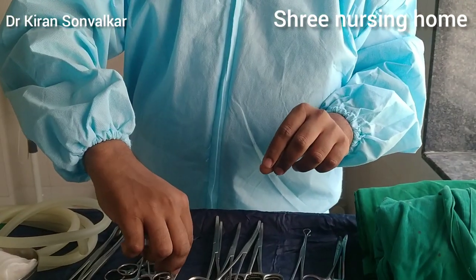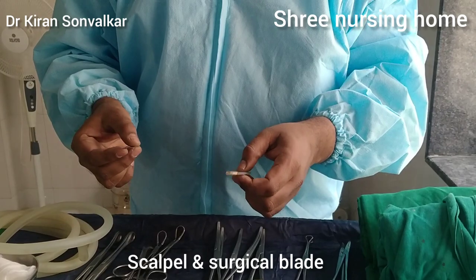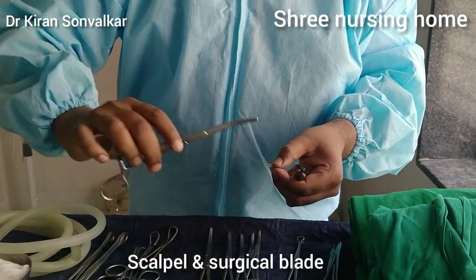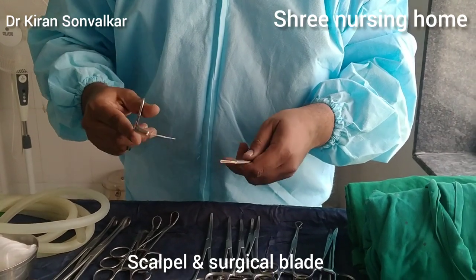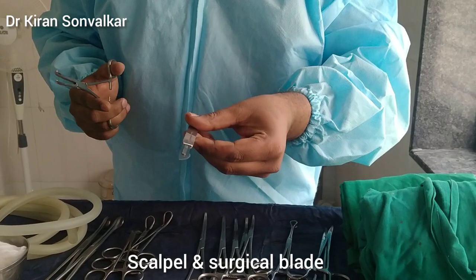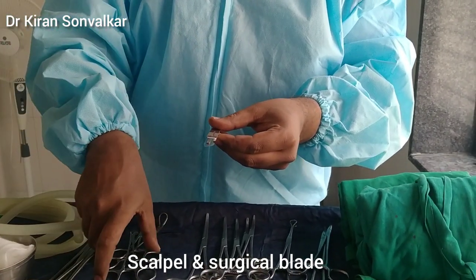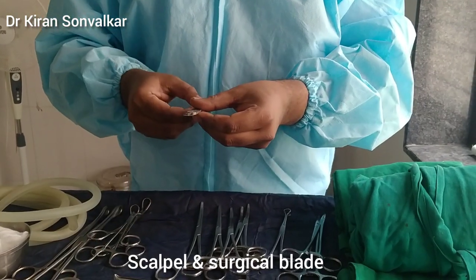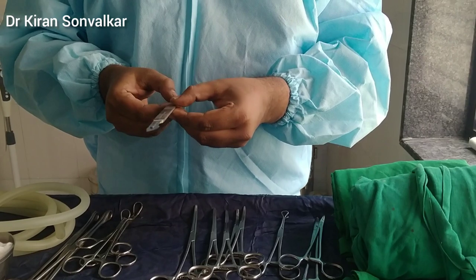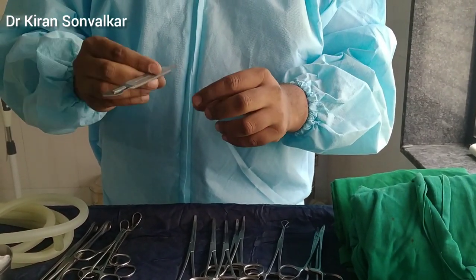The next one is scalpel and blade. This is a scalpel and this is a blade. So let's see how to fix the blade on the scalpel. This is used for taking an incision on the abdomen, opening the abdominal layers, and also for taking an incision on the lower uterine segment. You can use the blade for cutting the cord clamp.